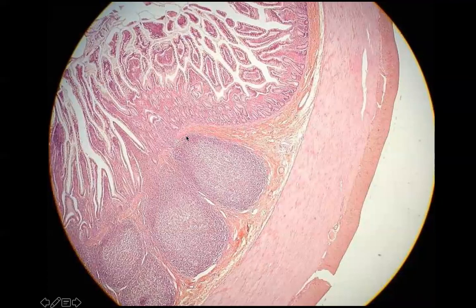And now you know that you're in the ileum, because up here is the mucosa. And then down here in the submucosa, holy cannoli, look at these giant Peyer's patches, or lymph nodules. These are what's responsible for that immune surveillance at that distal end of the small intestine. So all of this is the submucosa, and then out here, the muscularis externa.